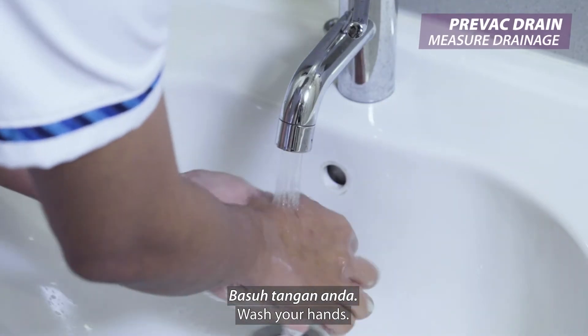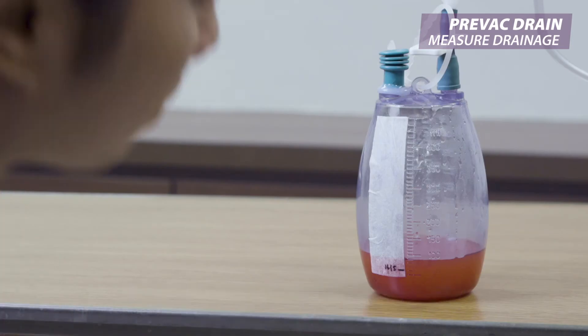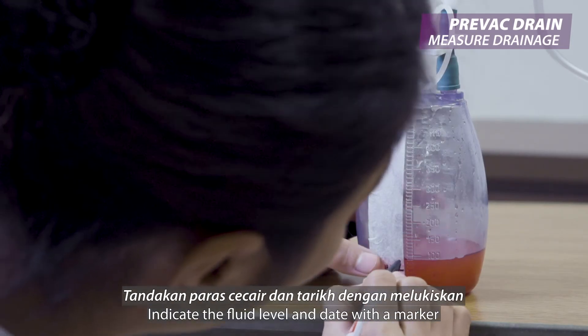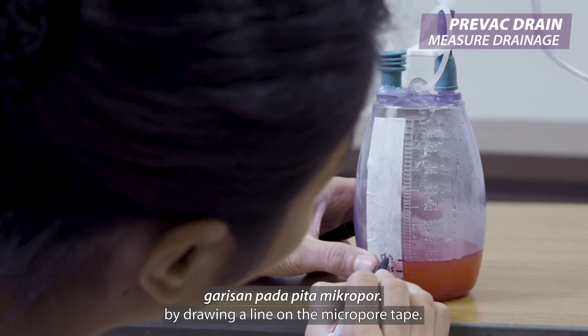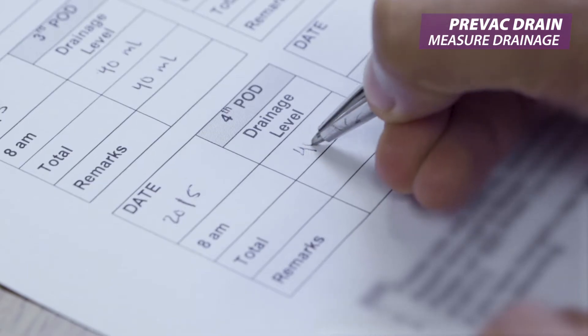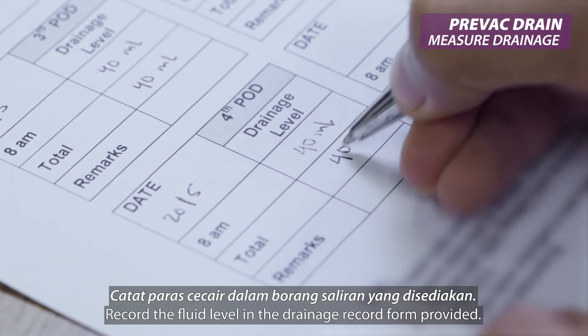Wash your hands. Place the Prevac bottle on a flat surface. Indicate the fluid level and date with a marker by drawing a line on the micropore tape. Record the fluid level in the drainage record form provided.